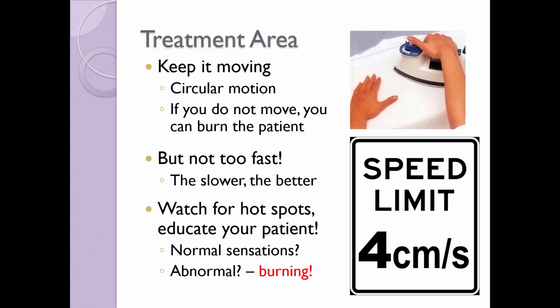Our treatment area. While treating the target tissues, make sure to keep the head of the ultrasound moving so you don't burn the patient or create hot spots. Most commonly, a circular motion is chosen by the clinician to keep the ultrasound head moving. While it is important to keep the ultrasound head moving, we do not want to move it too fast or we will not get the desired treatment. The slower the movement, the better. We want to move the ultrasound head at approximately 4 centimeters every second.